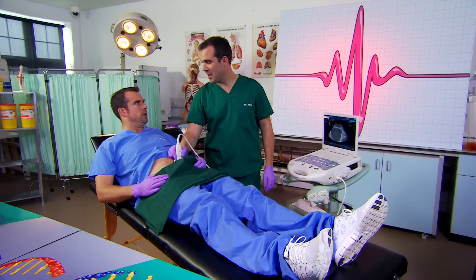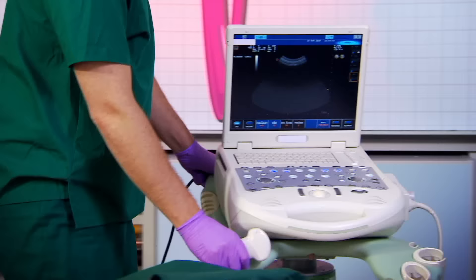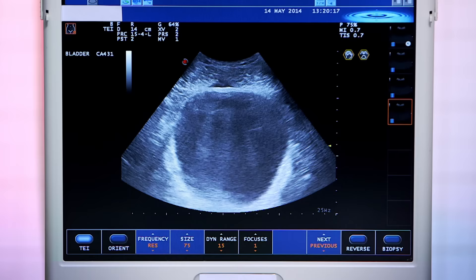All right, go ahead then. What, here in the lab? Just this once, on one occasion, you're allowed to pee in the lab, Chris. I think I'd better because I don't think I'm going to make it to the toilet. I'm going to hold the ultrasound scanner against my bladder while I'm weeing so you can see it shrinking as I go to the loo.